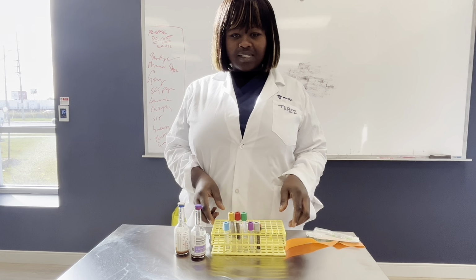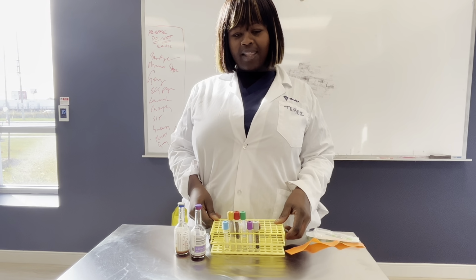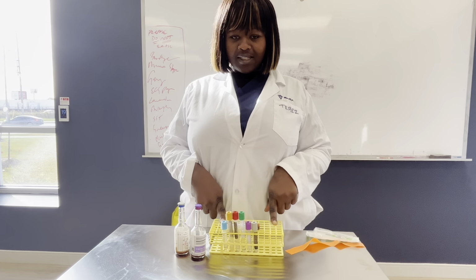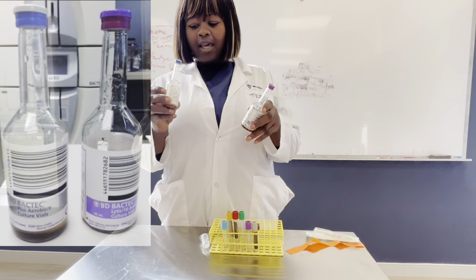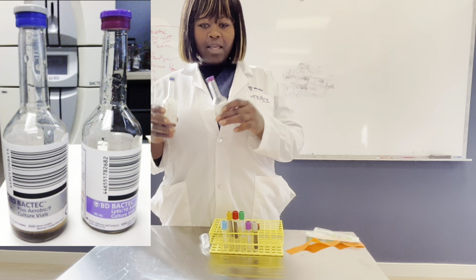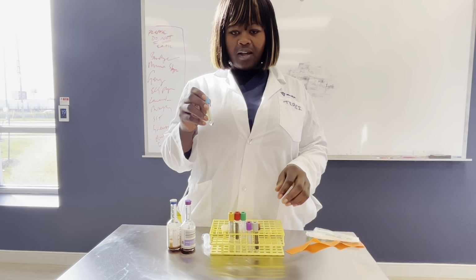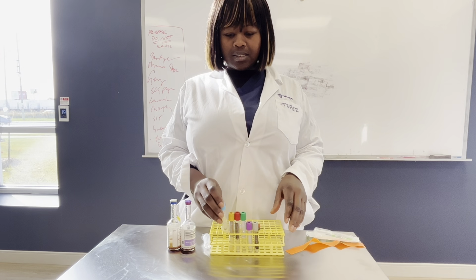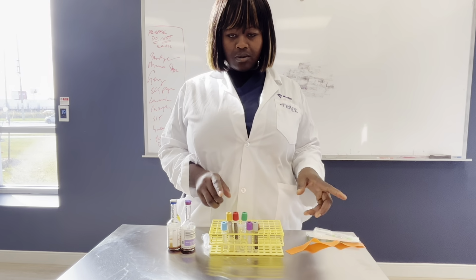So let's take a closer look at the additives in each tube and their specific purpose. For instance, the first in the order of draw are blood cultures. Here we have aerobic and anaerobic. The second tube could contain additives for specific tests such as coagulation studies. The third tube might include a gel separator to isolate serum from blood cells.